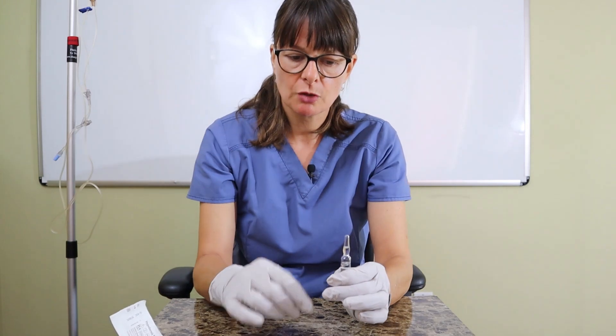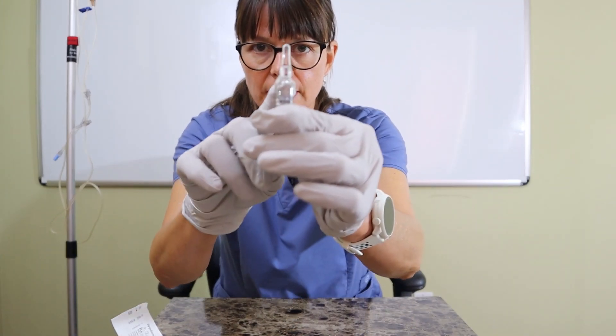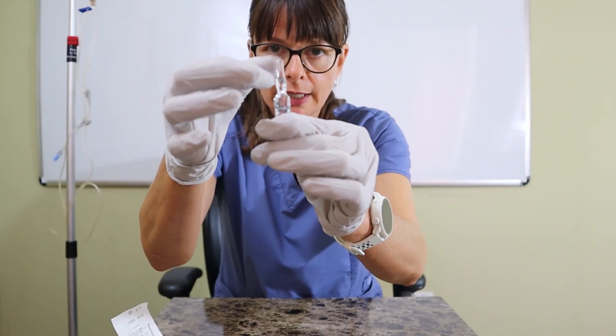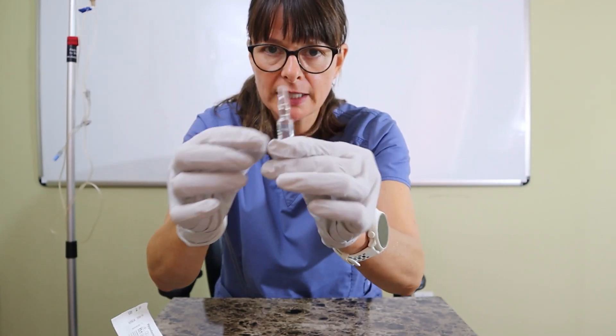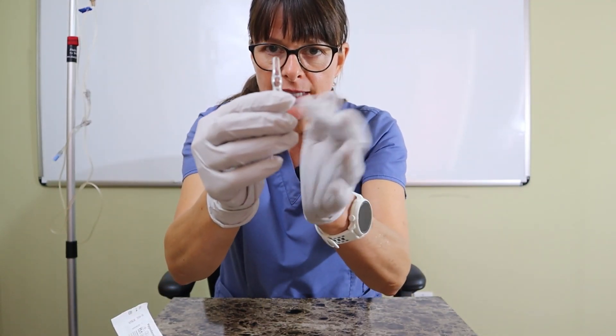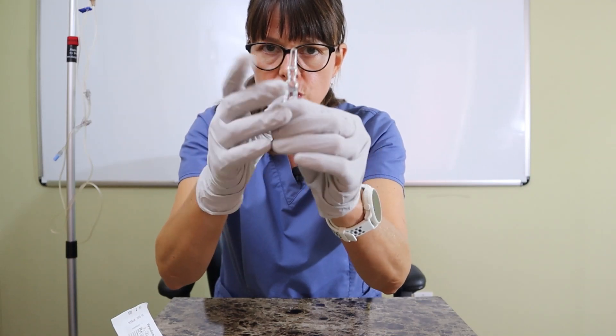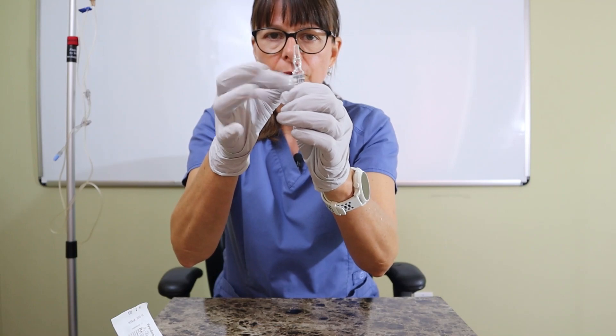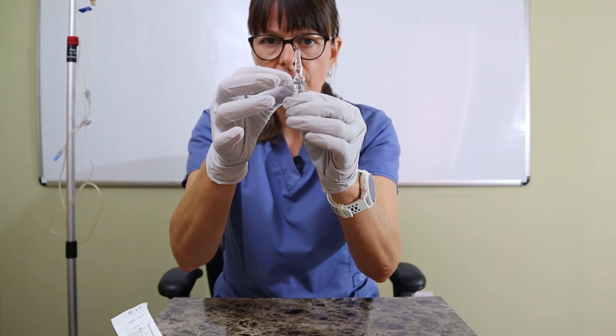The other thing to be careful with ampoules is that a little bit of fluid can accumulate on the top. You can either gently tap it, shake it, or tap it on the bottom, which will usually make that liquid go back down.